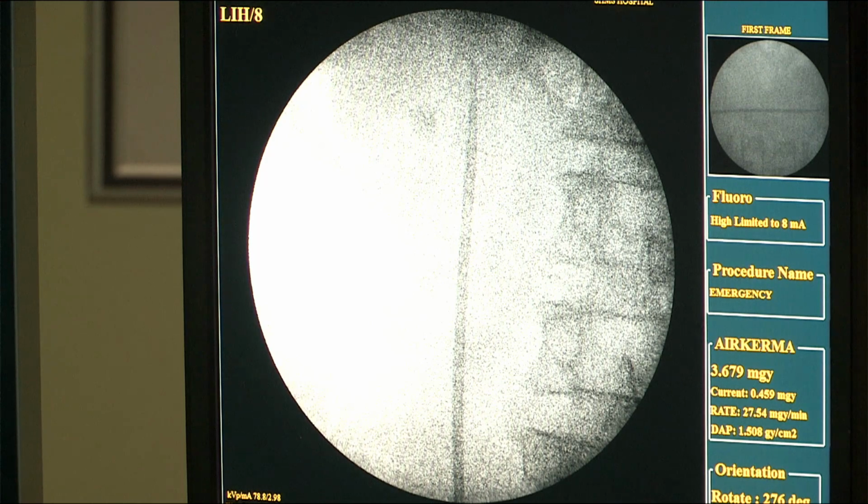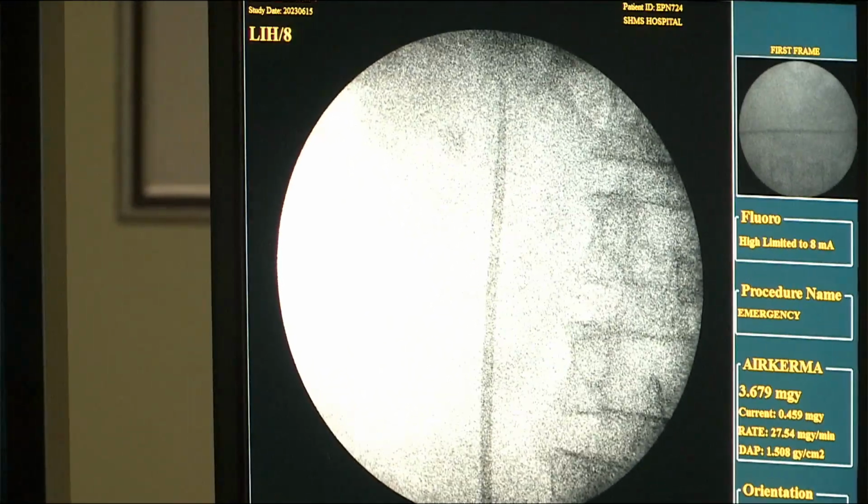After putting the SS sheath and removing the guide wire, we will connect it to the flexible ureteroscope, and then we will go. So you're using the Storz system here? Yeah, Flexus 2. What is the diameter? 8.4, 8.5 diameter, and now you can see the vision.